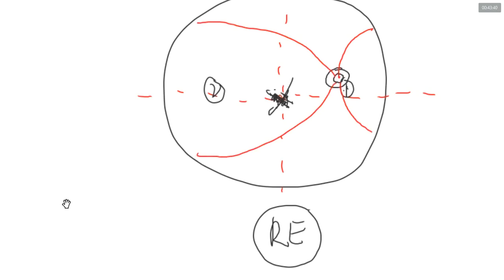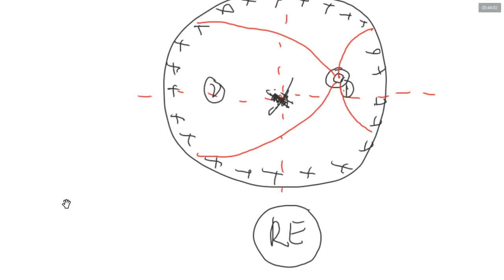Based on the findings of your examination, you draw whatever you can see in the fundus. Let's say the patient is post PRP, we draw scarring at the periphery. If it is a complete PRP, this is how we usually draw the fundus. If the patient has a scar, we draw the shape of the scar and then color it black. But let's say this is a patient with proliferative diabetic retinopathy.